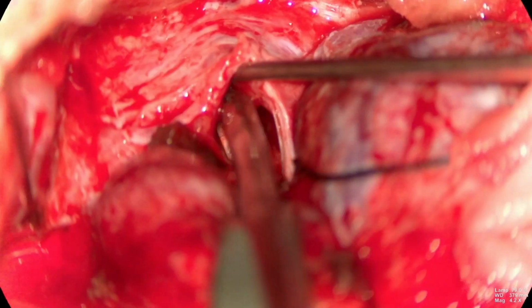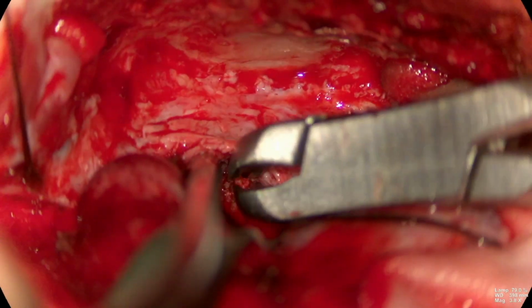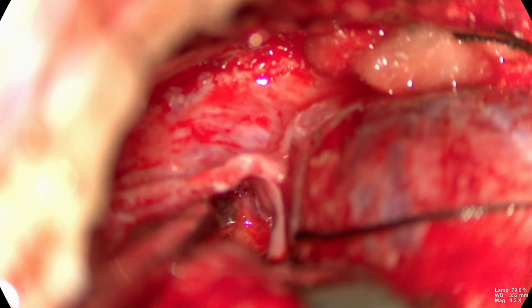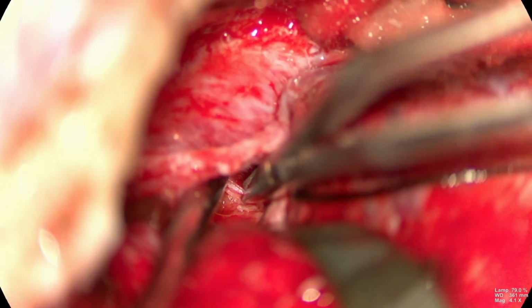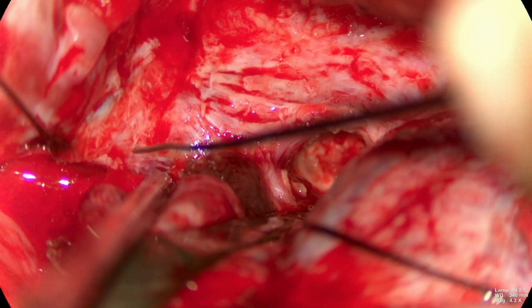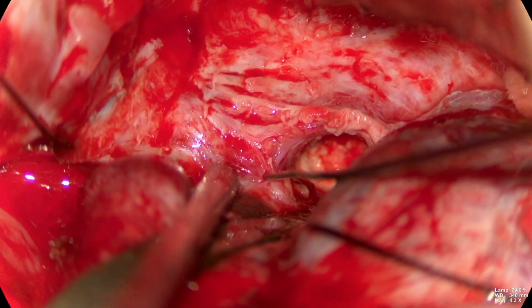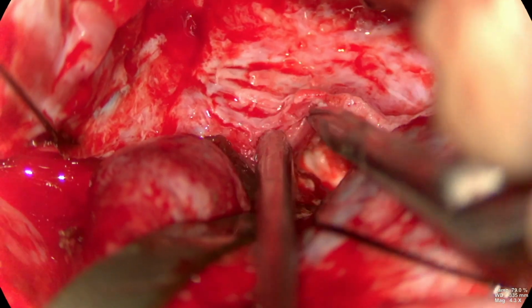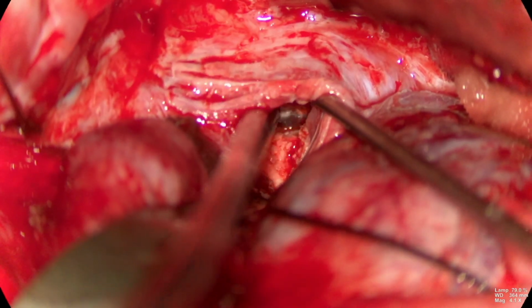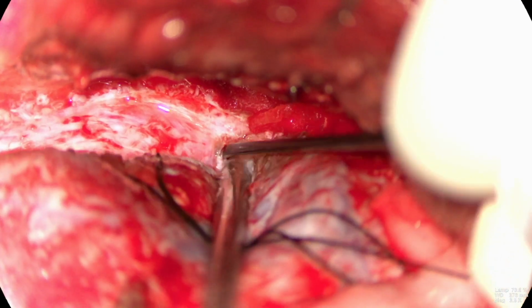The lateral part of the tumor was soft and suckable, and the medial part was very solid, rocky hard, and was removed piecemeal with the help of rongeurs. Now we are going to increase our exposure by dividing between the fourth and V1 division of the fifth nerve. Piecemeal removal of the tumor was done.